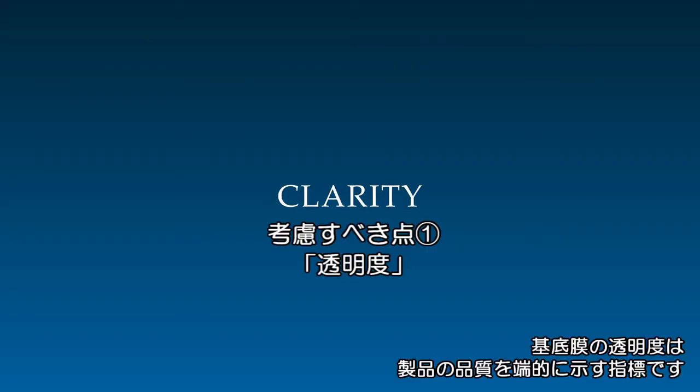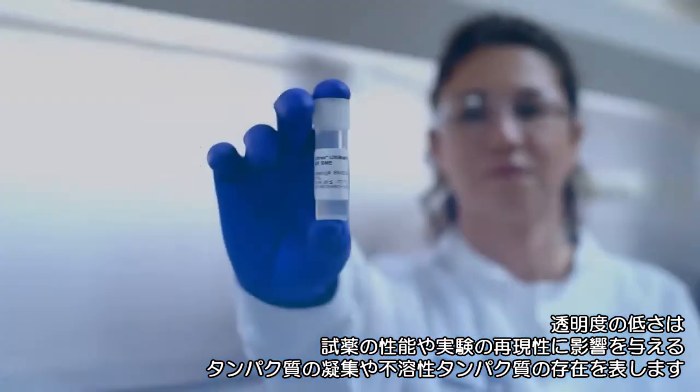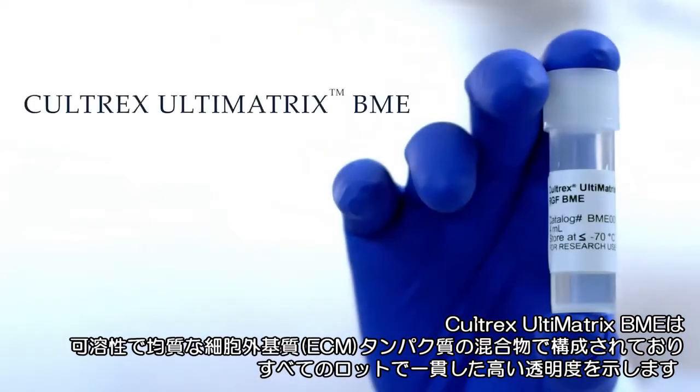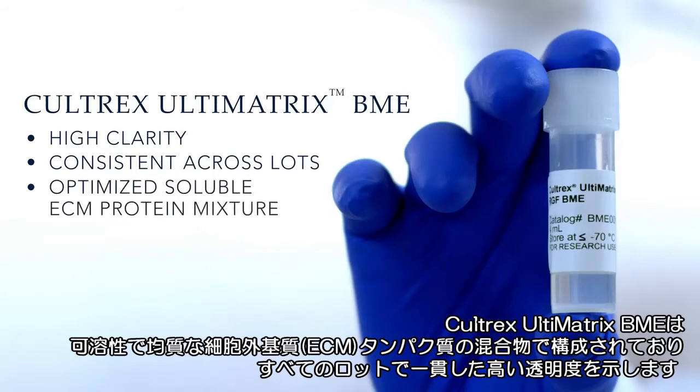Basement membrane clarity can be a quick indicator of product quality. Low clarity indicates premature protein aggregation or the presence of insoluble protein, which can impact performance and consistency. Caltrex Ultimatrix BME consistently demonstrates high clarity across lots, thanks to a manufacturing procedure that ensures the BME is composed of a soluble and homogeneous mixture of extracellular matrix protein.